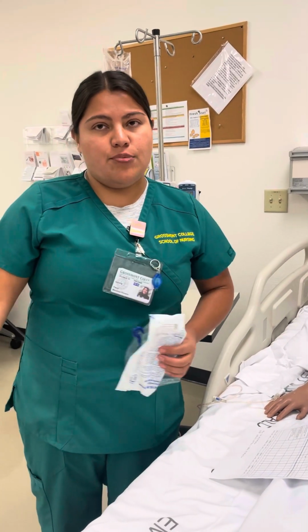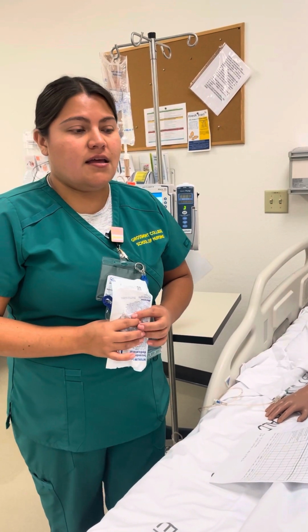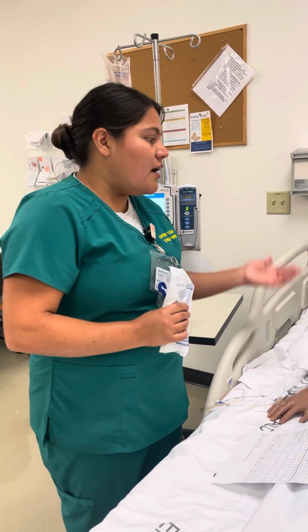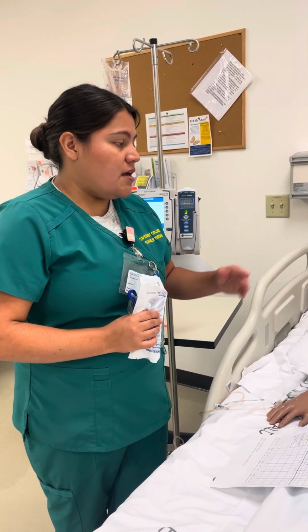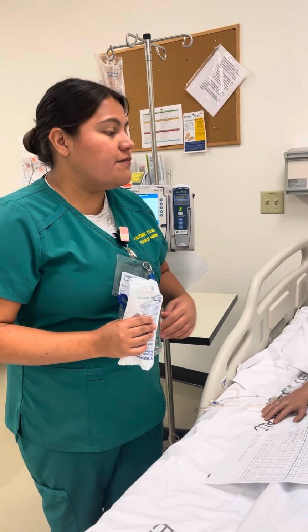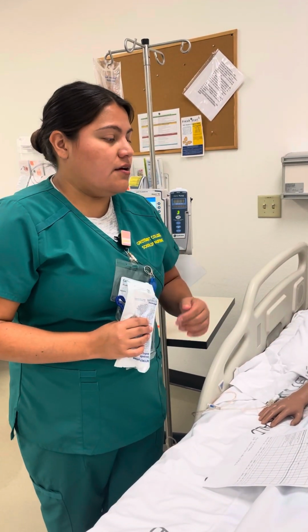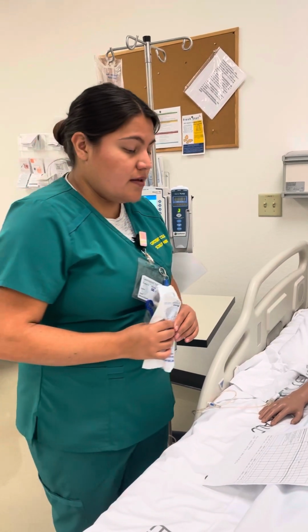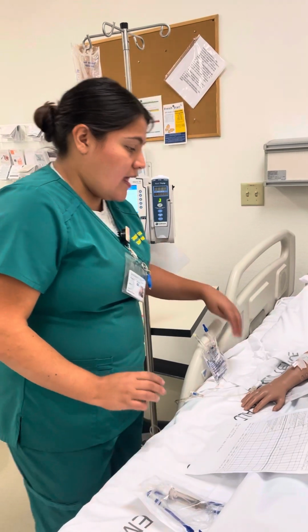I already did my pre-assessment where I check labs, BUN, creatinine. In this case, you have antibiotic medication for your stomach infection. So I check the signs of infection like fever, chills, and discomfort. Now I'm going to proceed to check the IV site.